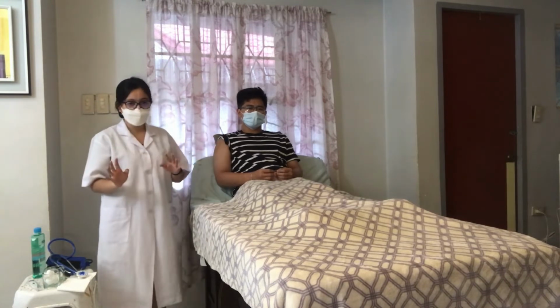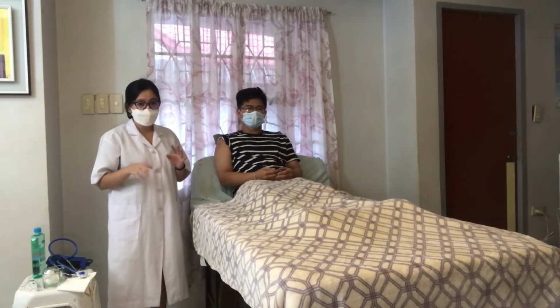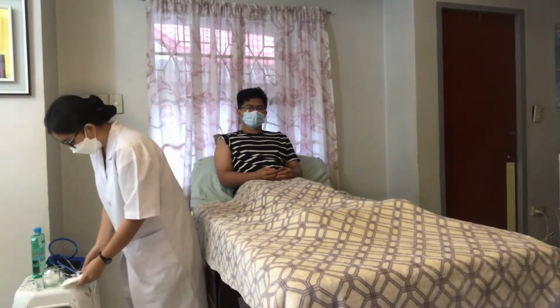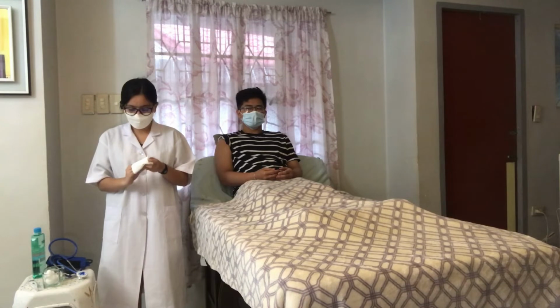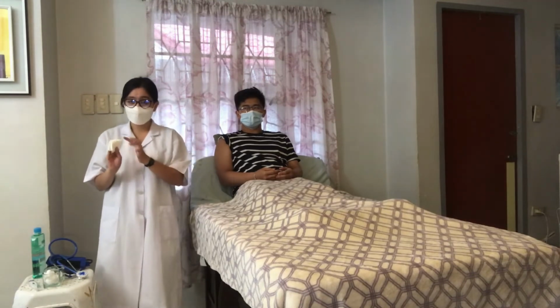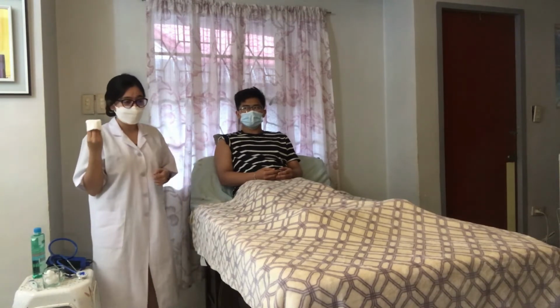Now, we have to determine if the patient's axilla is wet. If the patient's axilla is wet or moist, then we have to dry it with paper towel in a patting motion. So we are going to get our paper towel and then create 4 folds. We must make sure that there are 1, 2, 3, and 4 folds, and each side should touch only once to the patient's axilla.